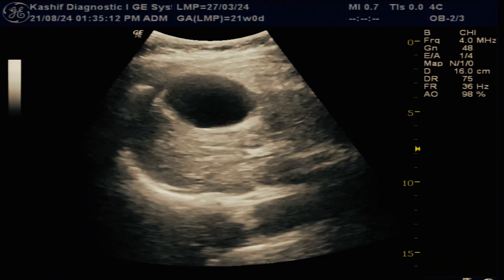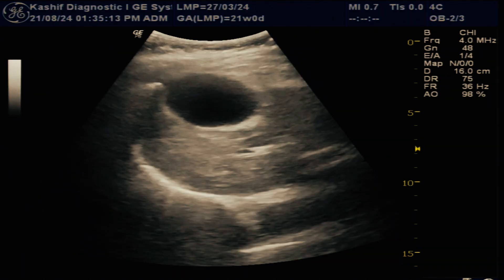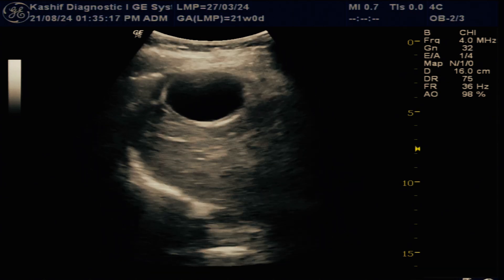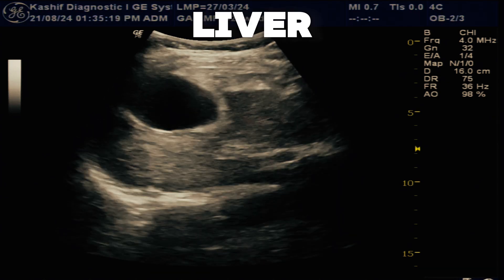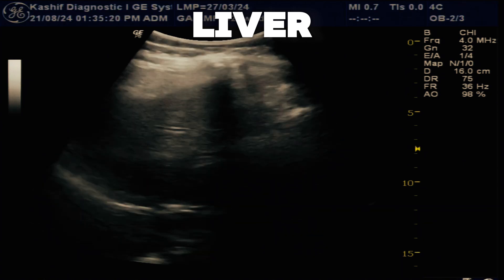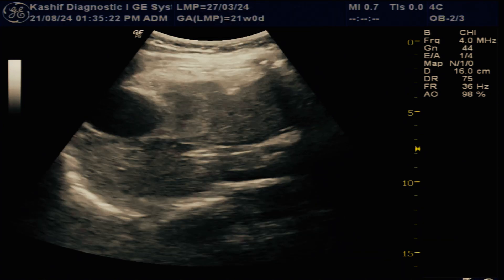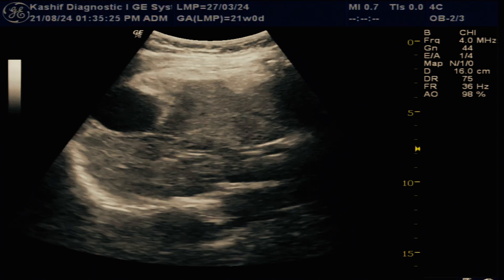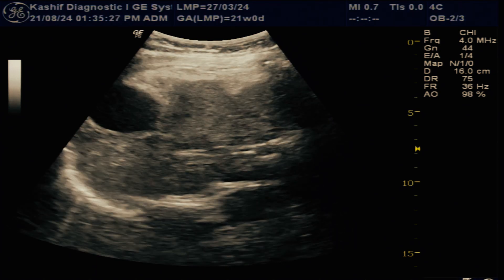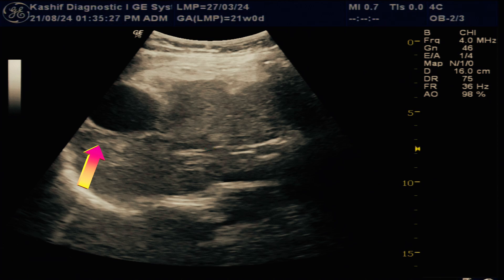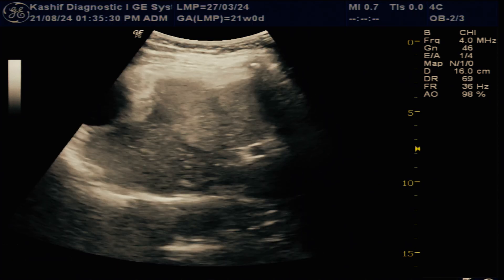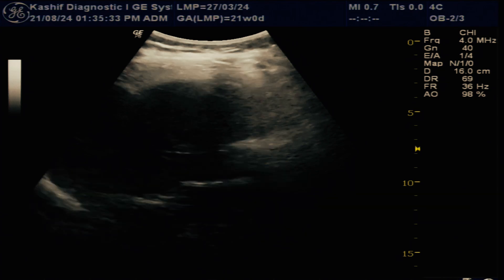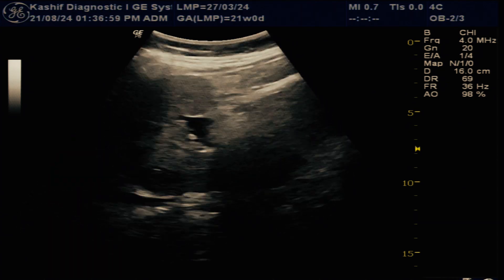This is a case of a 34-year-old female with gastric problems. Ultrasound is started from the right upper quadrant as a normal routine scan. We see that the liver is normal, but there is a simple cystic area in the right lobe of the liver. In the right upper quadrant, the gallbladder is not visualized.